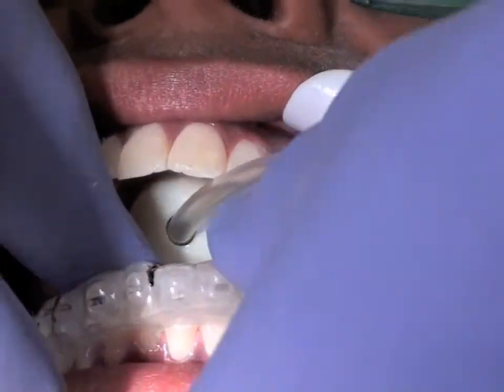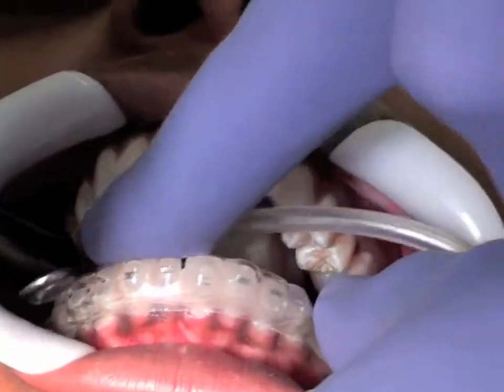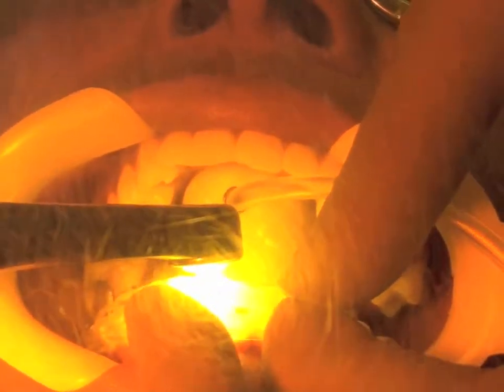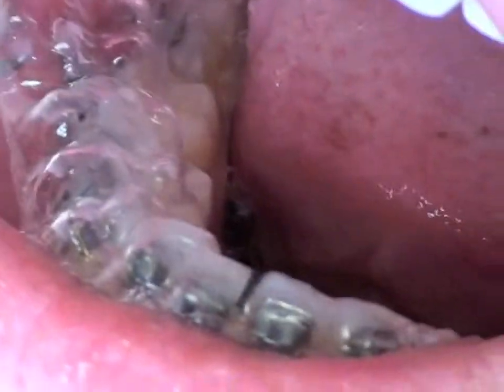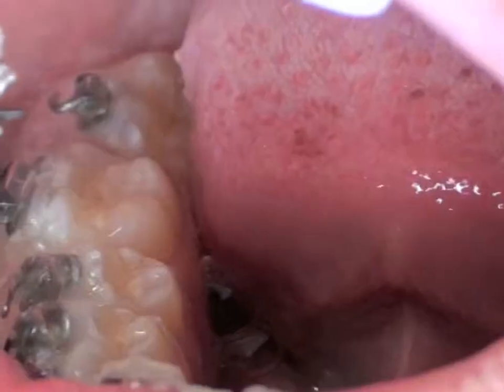The tray is placed by the doctor and visually checked for occlusal and buccal adaptation. We use the VALO curing light, which is a low profile 90-degree plasma simulation light, for a three-second cure occlusal to each bracket. This close proximity to each bracket and wide collimation of light yields quick curing and minimizes early bond failure.